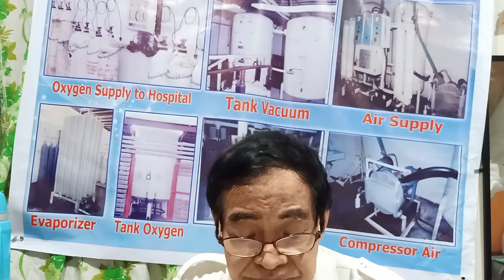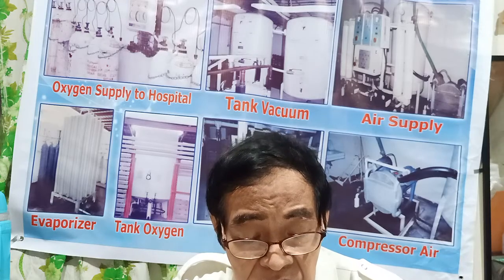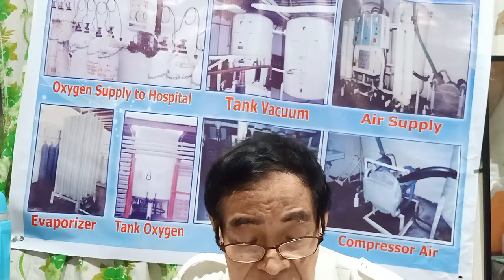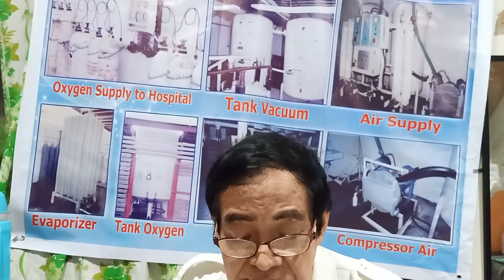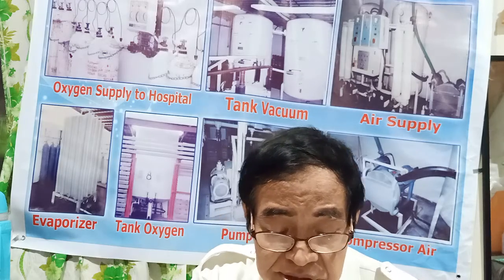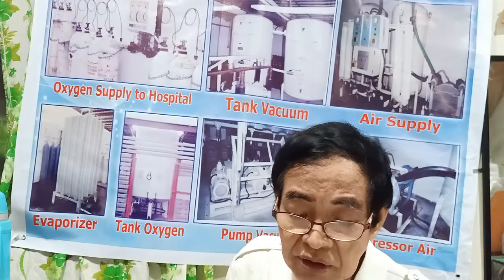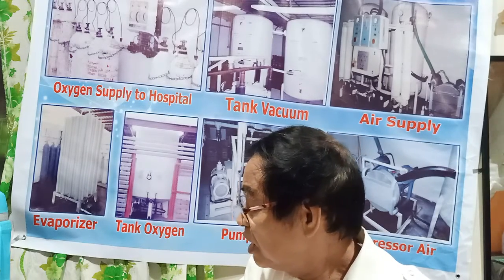And also about the release of gas mixed within the surrounding air. Therefore, there is no need to take special action in the event of the fire.